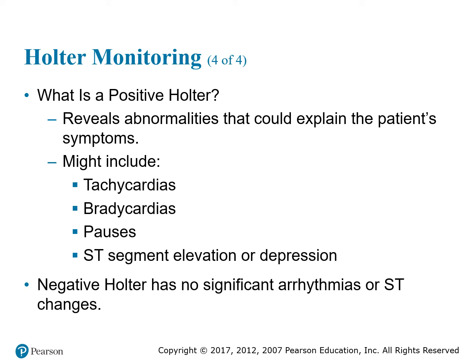They can interfere with the tracings because it's all electricity. It's all current. It's just like when we're doing an EKG with the EKG machine, we can't really have any electrical devices near us because they cause an artifact. It's the same thing for a Holter monitor. They can't be around any high-powered electricity.